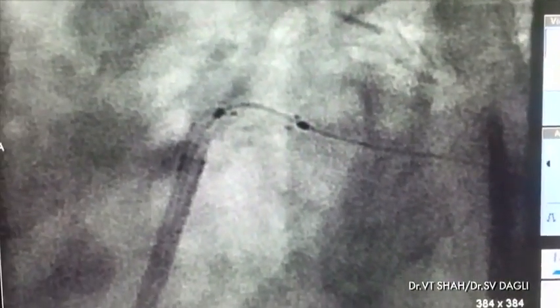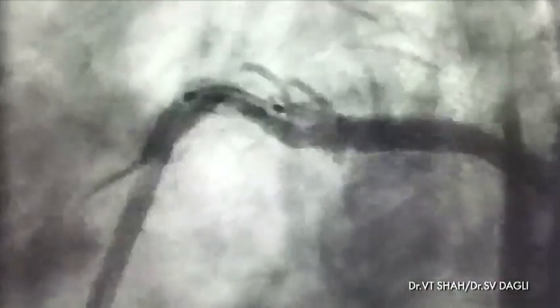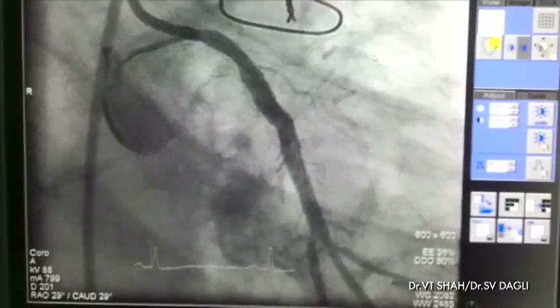being deployed. You see again the markers on the Absorb stent, as I said, the hallmark of the stent, and this is the placement of that fourth Absorb stent being done. And as you see here, the positioning is being done and then the stent is deployed. We show you the markers, the distal marker and the proximal marker, and then the marker which you see here belongs to the stent which is down below deployed.